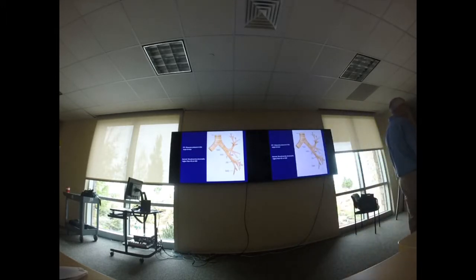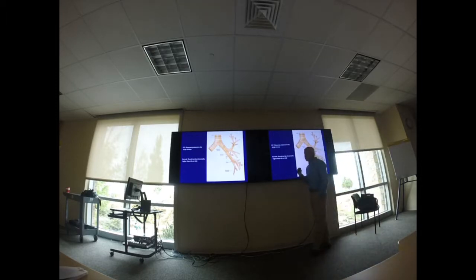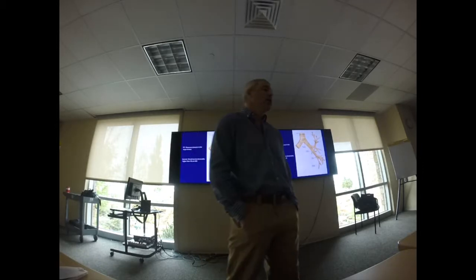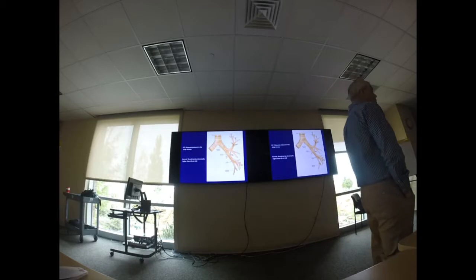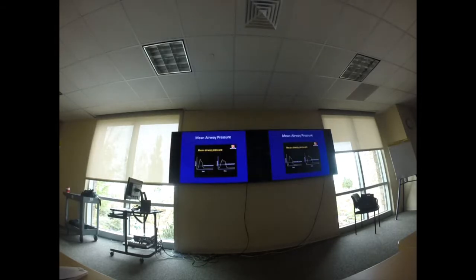So I think about some kind of increase in pressure in my bronchioles, my trachea, my endotracheal tube, my circuit, something like that is causing an increase in my pressure for one reason or another. So I think peak inspiratory pressure, large airways, and it's the greatest amount of pressure applied during inhalation is the definition of my peak inspiratory pressure.